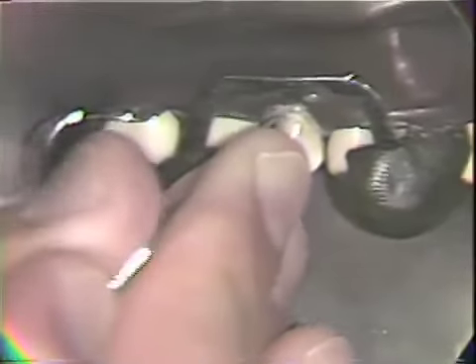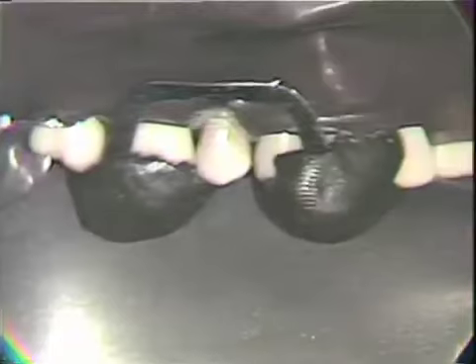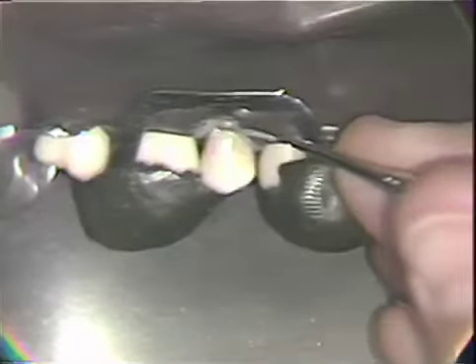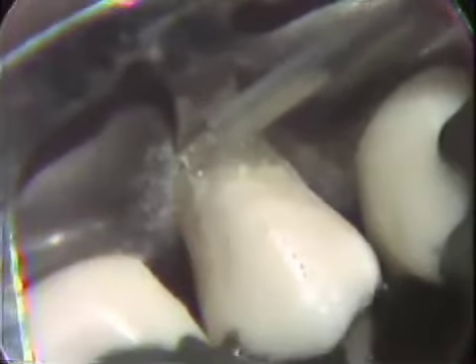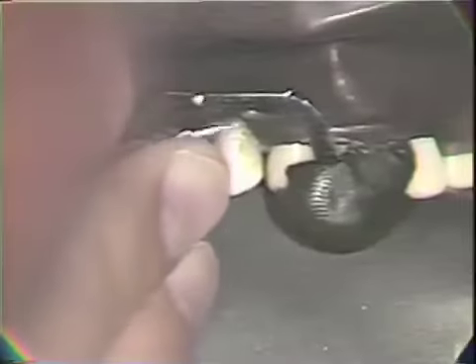And then we'll use the Wedelstaedt chisel in order to plane the cervical margin here first. The straight line to the outline form is appropriate from the standpoint of convenience of forming the outline form, as far as cavity preparation is concerned.